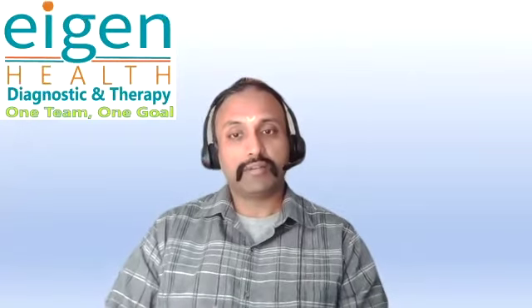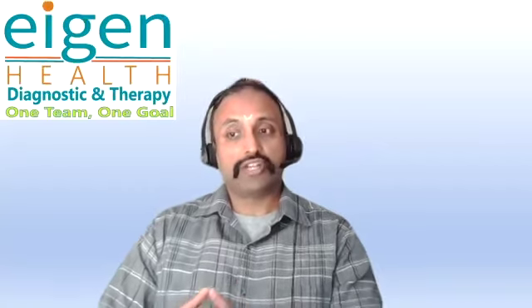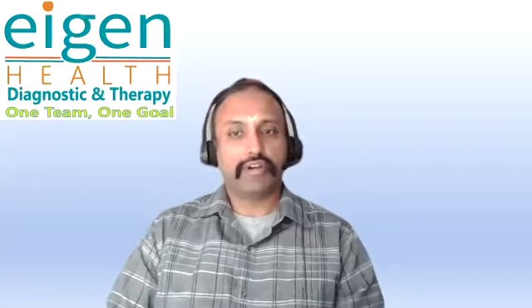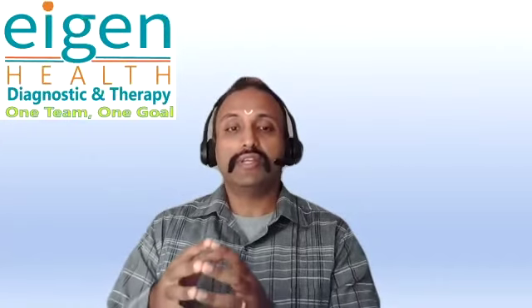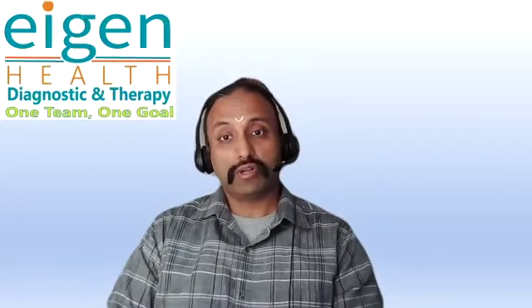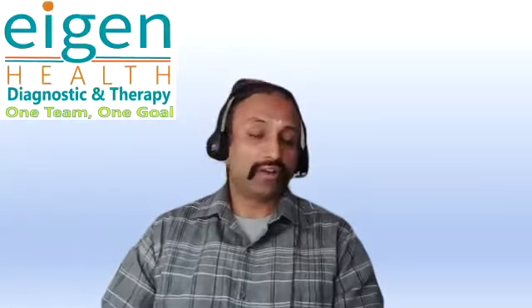This is a very critical piece if you're working on a medical device that actually has a hardware component to it. If you're working on a software component only, this simulator doesn't make sense. You have the software, you don't need anything special, so you just develop the software. But only when you have a hardware piece, having the simulator really speeds up development, maybe about 5x or 6x compared to having a device and not having a simulator.